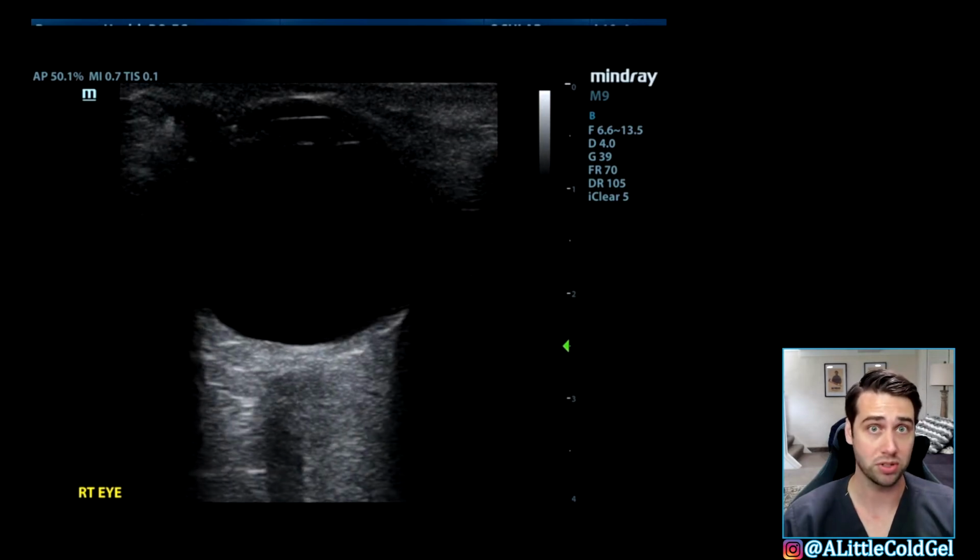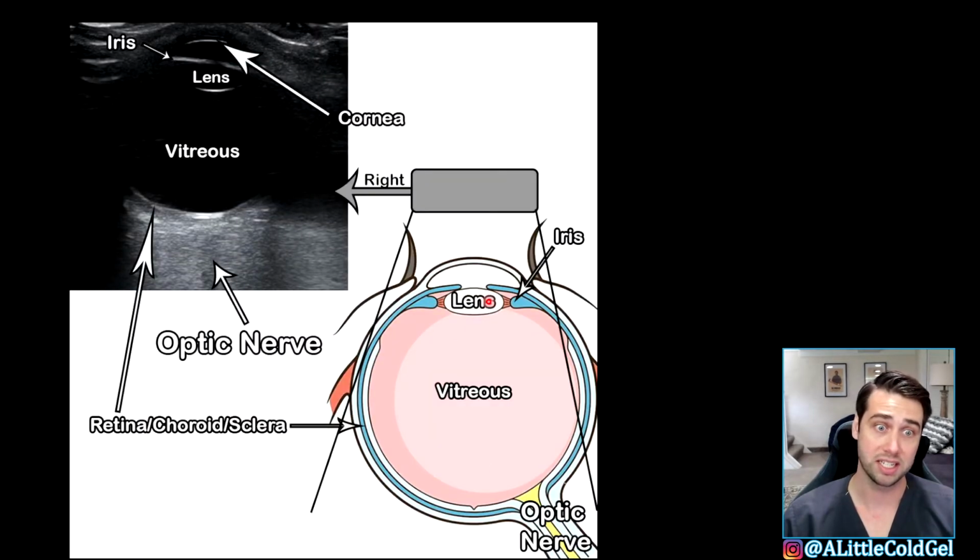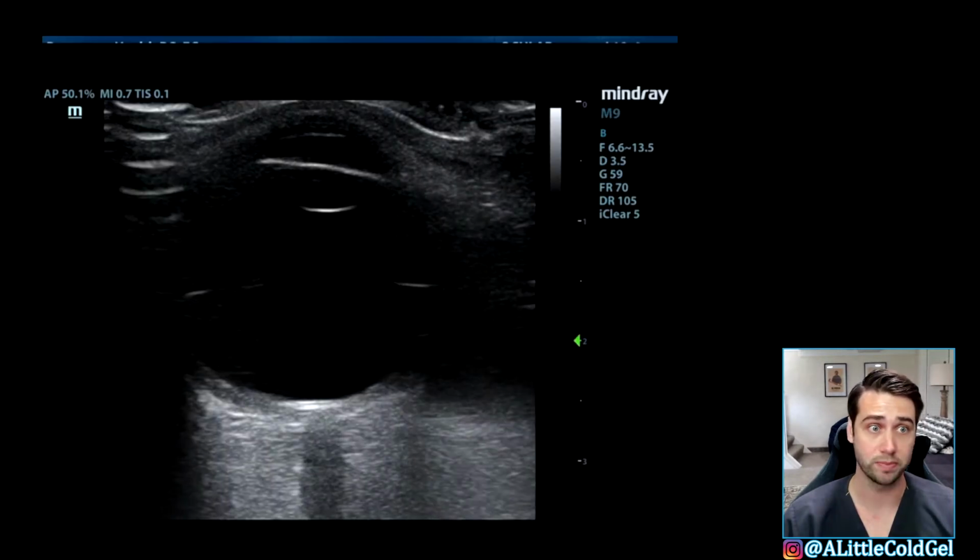Now the anatomy you're going to identify here kind of consists of a couple things. The lens, the posterior segment. You're going to want to check this entire posterior area here, which contains the retina, the choroid, and the sclera. And I think that's something we sometimes forget when we're doing ultrasounds, is that there's more back here than just the retina. And then finally, you're going to want to identify the optic nerve. So let's look at this next image.